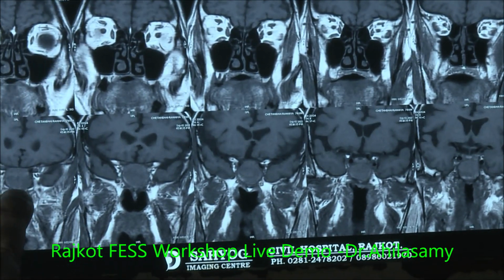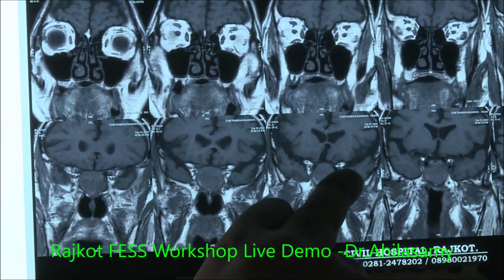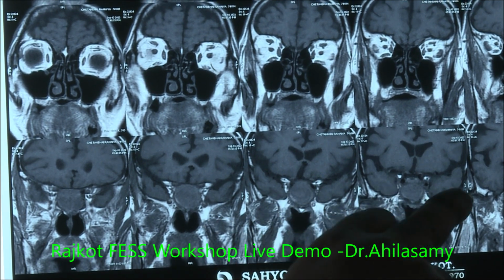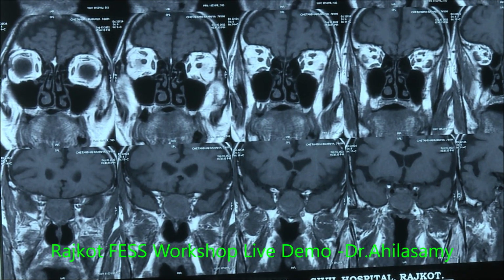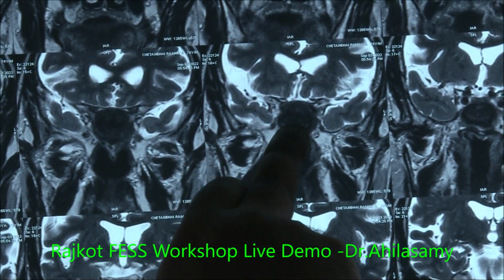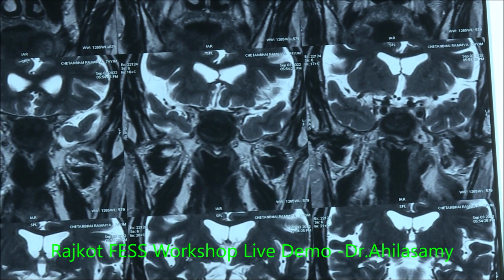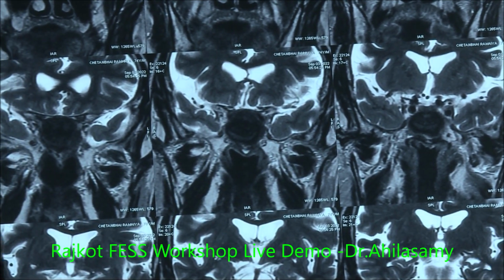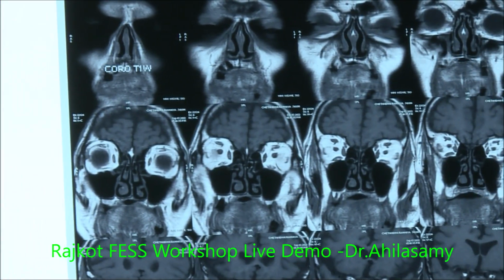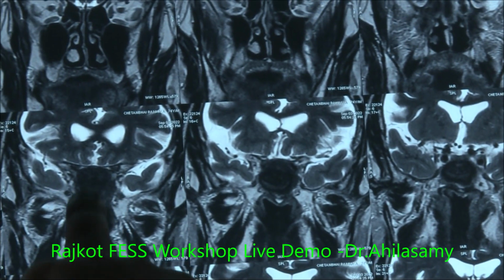This is a mass. It looks like a pituitary mass in the sphenoid, and the carotids are away. It's a hypointense lesion, and in T2 also it is hypointense. So it mostly favors a fungal pathology. If it were acute sinusitis, chronic sinusitis or mucosal disease, it would be bright in T2.